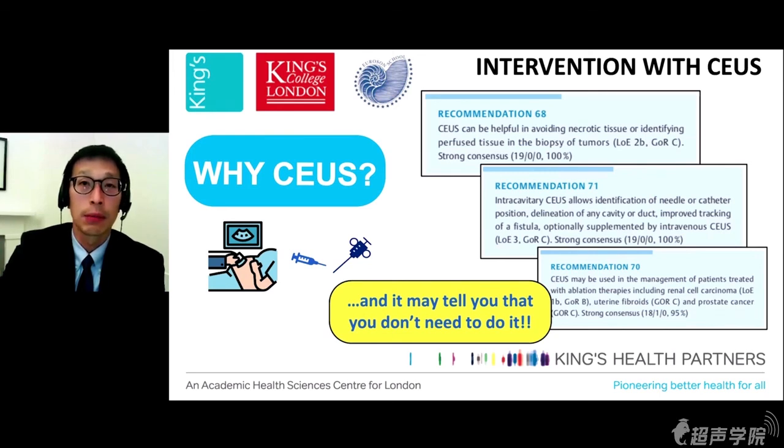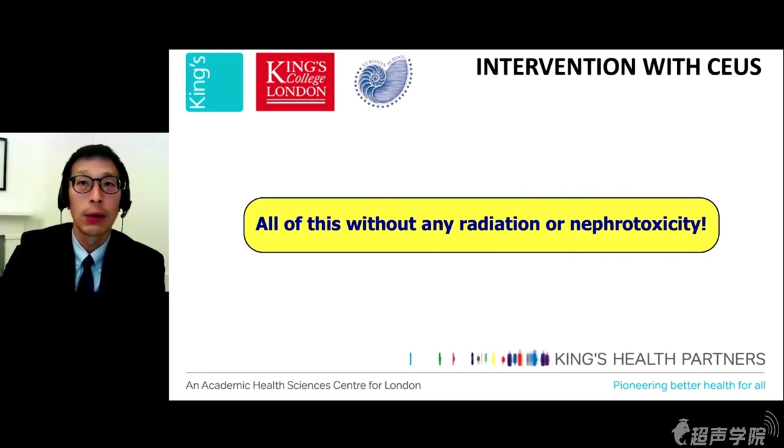So these are very important, because you can achieve all of this without any radiation or added nephrotoxicity. This is particularly important when managing patients at risk, such as patients with renal impairment, children, or patients for whom a transfer may have added risk.